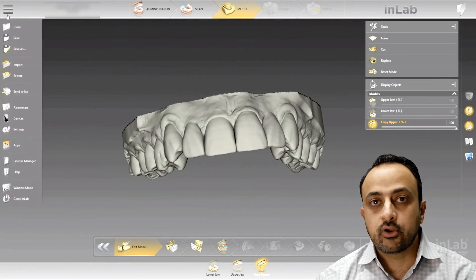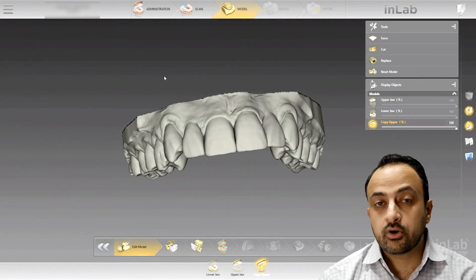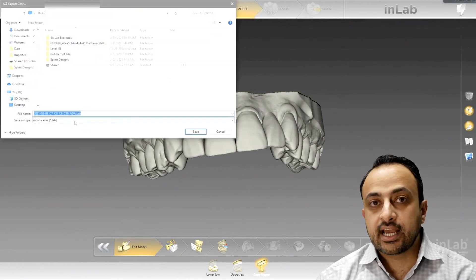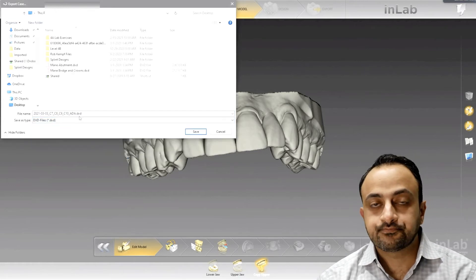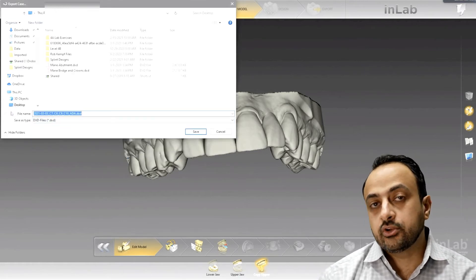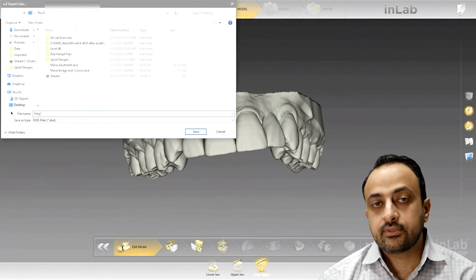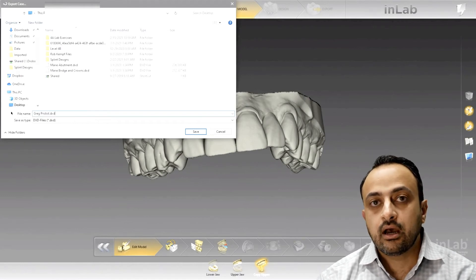I'm going to go up to the menu, click on export, and I will export this file as a DXD file. DXD is the universal file type that we can use to communicate between InLab and CEREC Chairside.